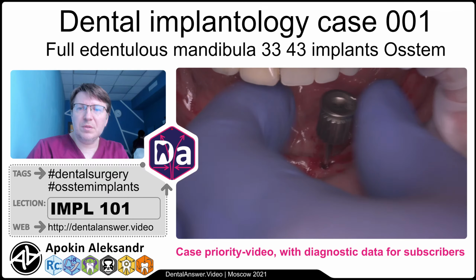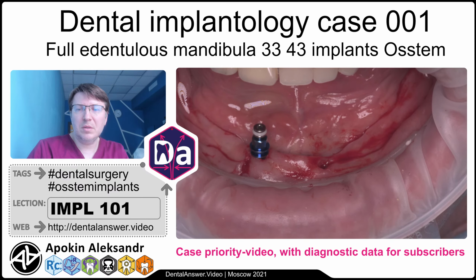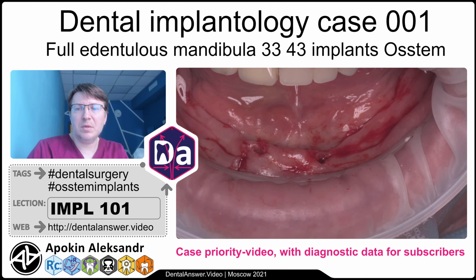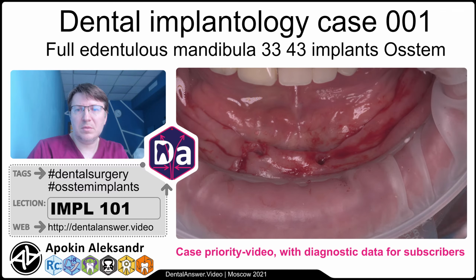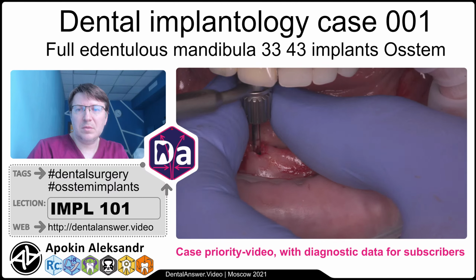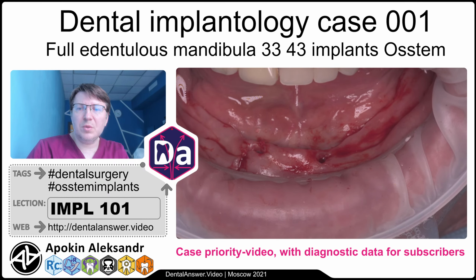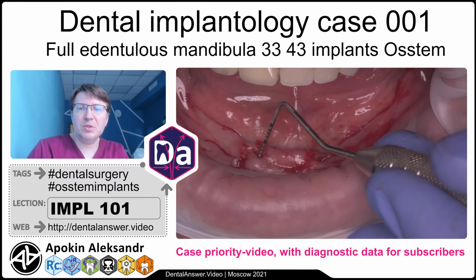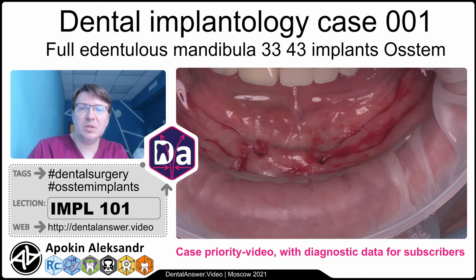After this screw is finished, we also remove the next mounter and also cover the implant with the screw. Here it is. The next stage, we need to close these incisions. I'm checking the position of the implants. It is bone level. I'm using the standard hygienic sterile probe.